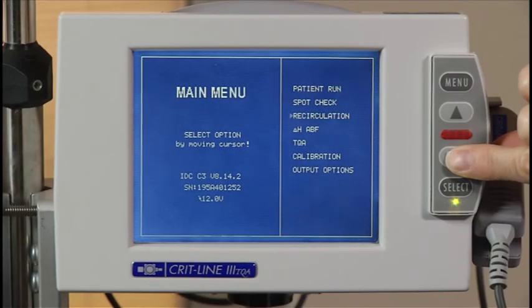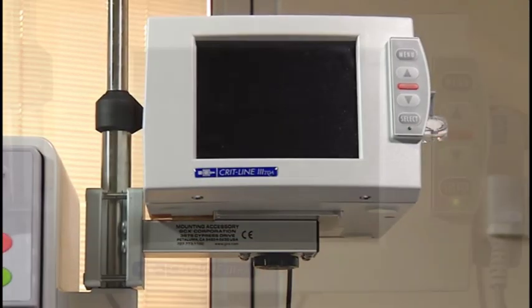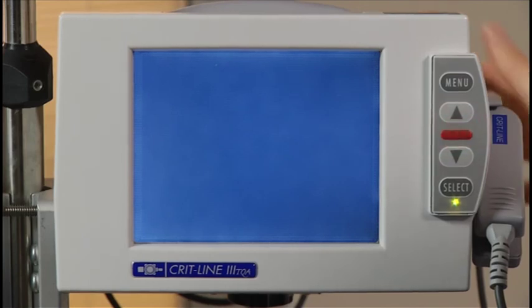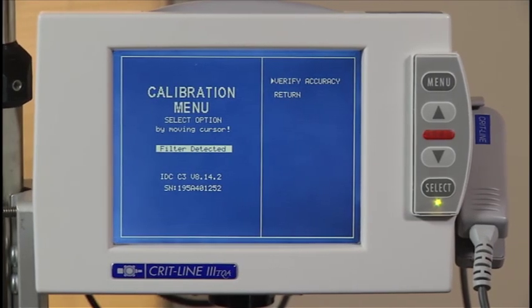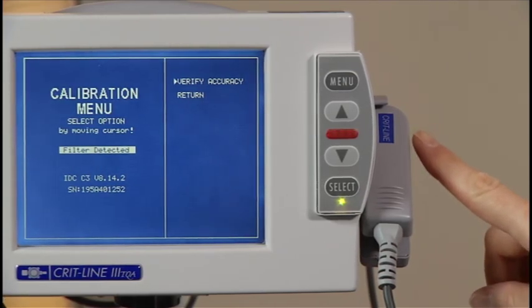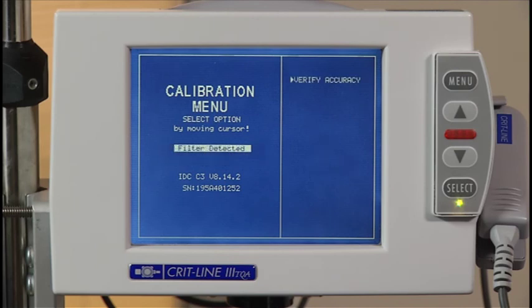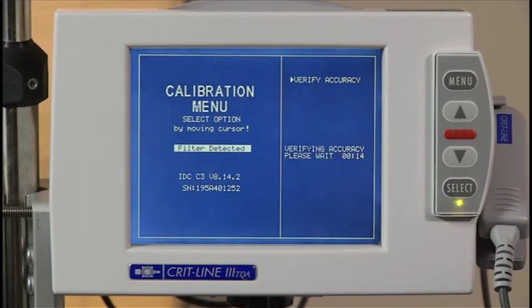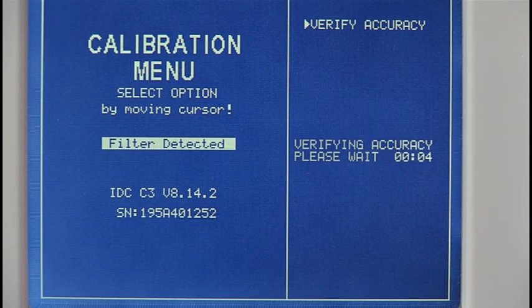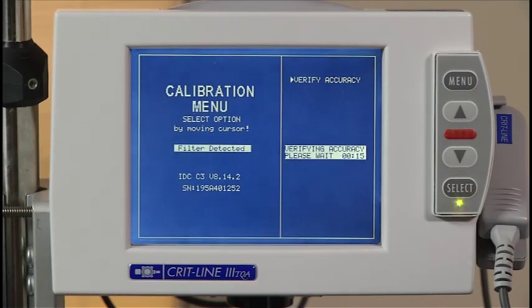To verify the accuracy of the CRITLINE monitor, scroll to calibration from the main menu and press the select button. If more than 30 days have passed since the last verify accuracy test, you will see the calibration menu when you turn the monitor on instead of the main menu. Make sure the sensor clip is placed on the verification filter on the side of the CRITLINE monitor. Wait for the monitor to detect the verification filter and display the filter detected message. Once you see this message, move the cursor to verify accuracy and press the select button. Wait for the two-minute countdown process — the elapsed time remaining will display. If the verify accuracy test fails, you will be asked to confirm proper sensor placement and ensure the filter is clean, then press select to repeat the test.